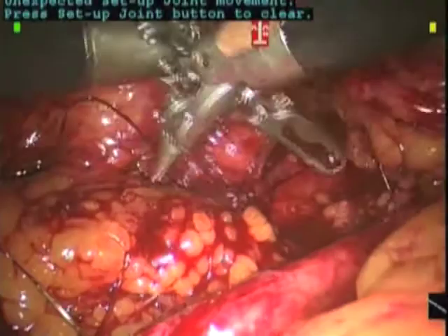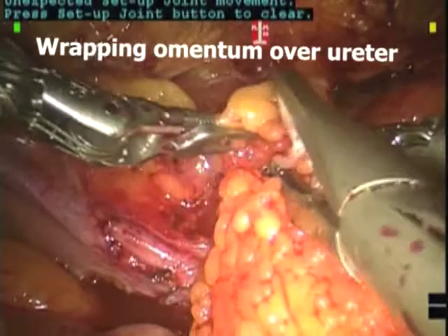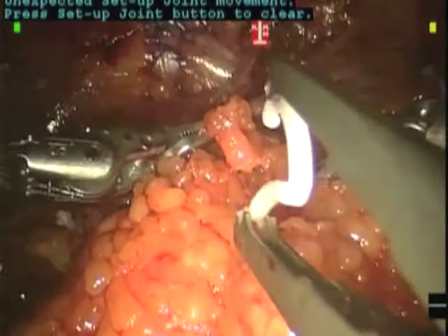At this point the entire area has been buffered with omentum posteriorly from the pelvis down toward the bladder. We then pass the medial aspect of the flap over the ureter and again secure it to the sidewall. It is this maneuver that creates the full circumferential omental wrap.